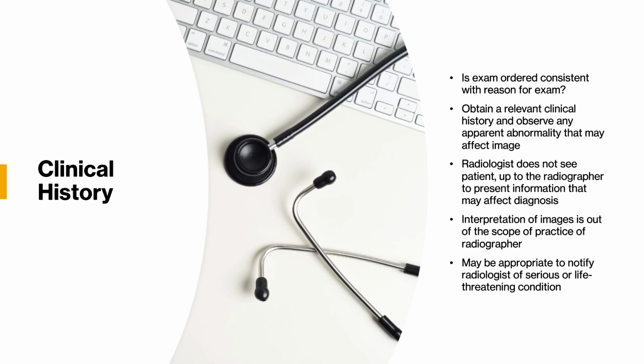If that is the case, that's something that could be documented for the reading radiologist. The radiologist is not going to see the patient, so it's up to you to present the information that may affect the diagnosis. So if somebody has a specific abnormality that doesn't allow them to be set up in that perfect A to P, that's something that you'll have to make sure that you tell the patient or the radiologist so that they're aware.